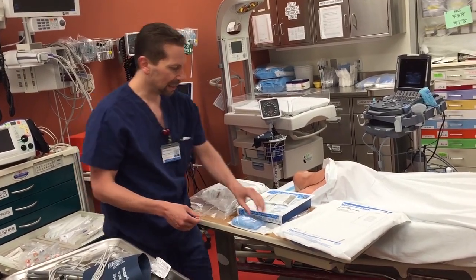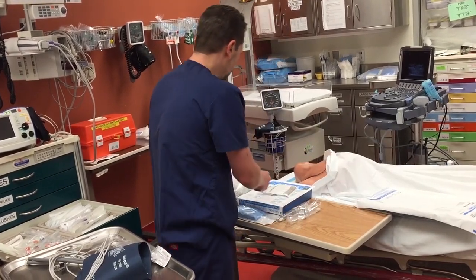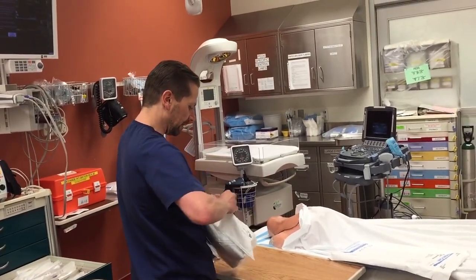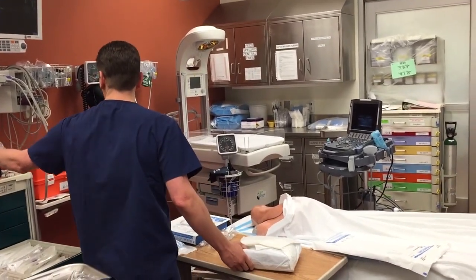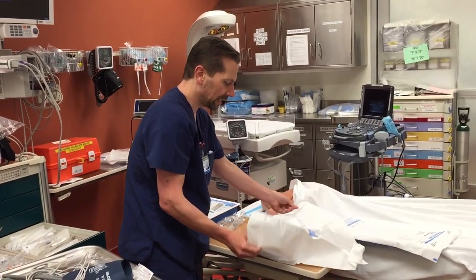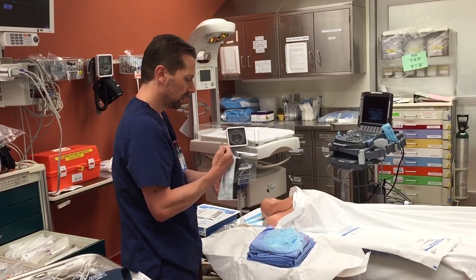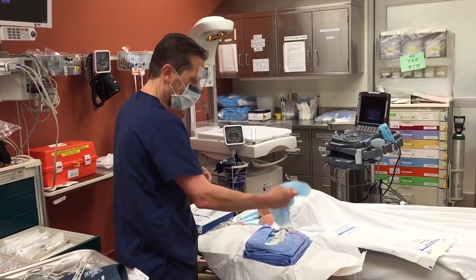What I like to do is first open up this bundle. This bundle is horrible, ill-conceived, and predisposes you to making the line non-sterile, but we have to work with what we've got. So let's open up this bad boy. And I'm going to reach in and put on my mask, then put on my hat.